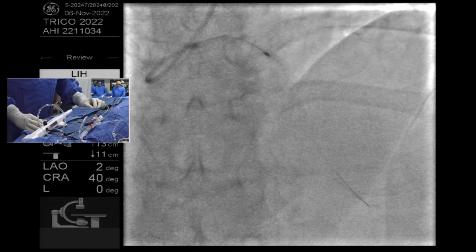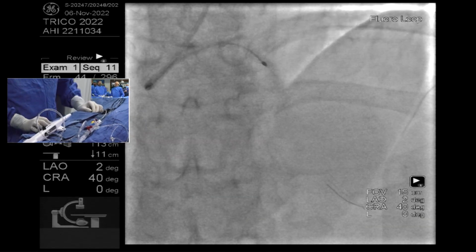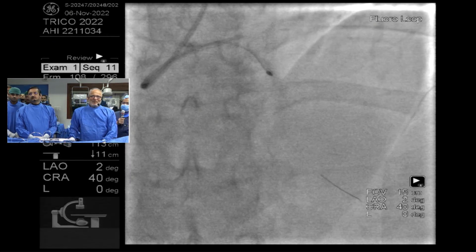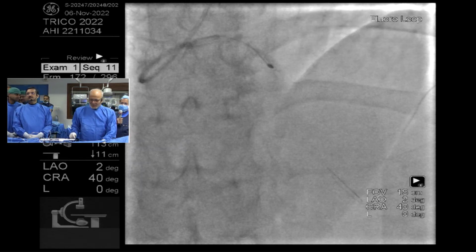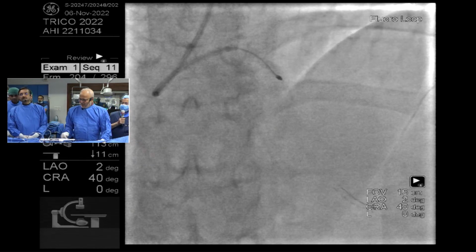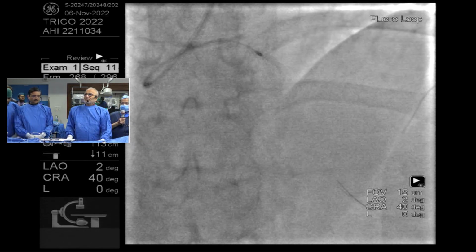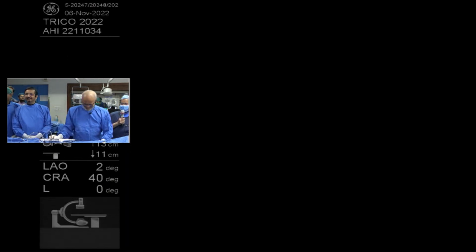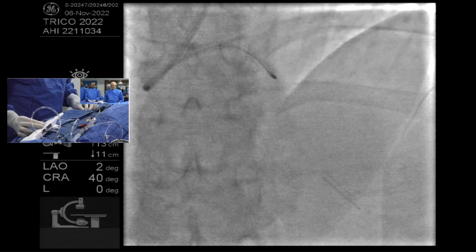This is making me nervous. I think it'll take more passes. But you anticipated that. Sanjay says that you take 1.25 and go at a very high burr speed. What is the opinion, or what do you feel? I think it'll take you another 7 to 8 passes before it'll cross. Go to 180 now. No problem. Increasing the frequency, 180,000, yes.